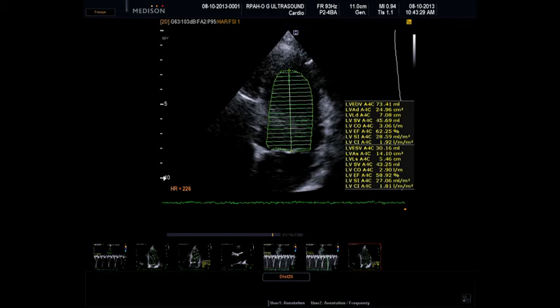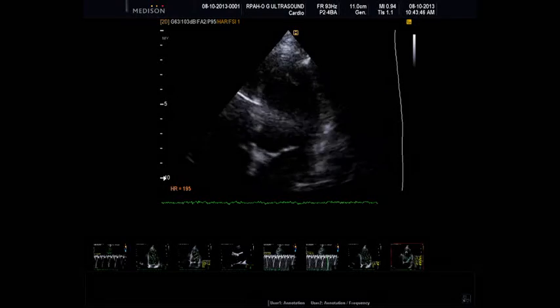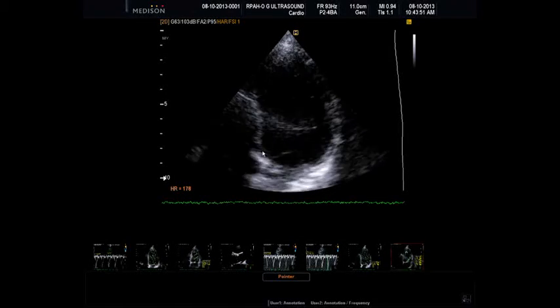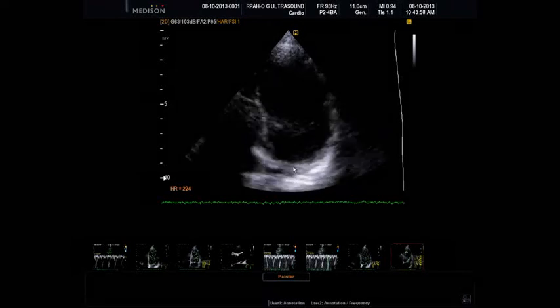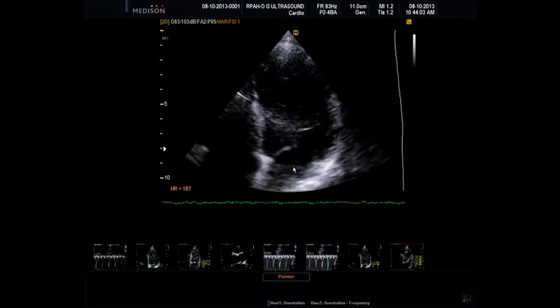And we get a stroke volume and cardiac output. I'll just demonstrate from the 4-chamber, but to get a more accurate measurement, you repeat this in the 2-chamber view. But this view is actually nice. We do the measurement, but you actually spend your time looking at the chamber, assessing the wall motion and the septum, and making sure that it's all moving in time. And she's got a good squeeze.